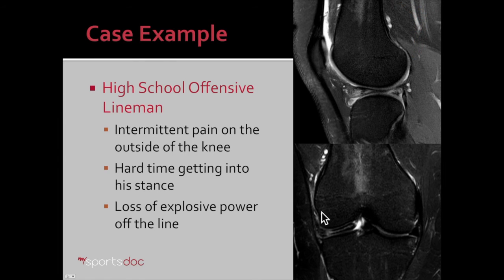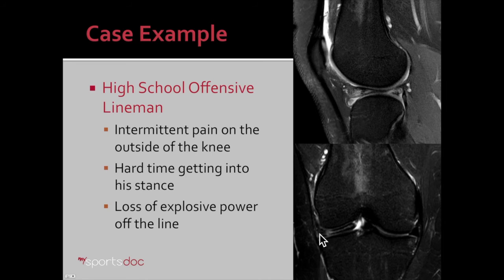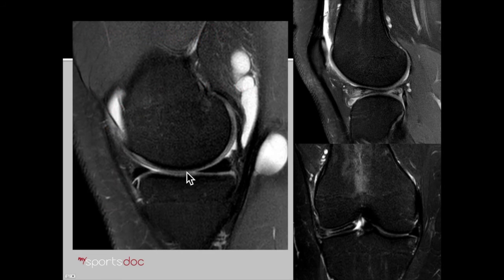Here's his MRI — the same sagittal view we saw before. You can see the discoid meniscus goes all the way across the knee. Looking at that from the front, instead of seeing the c-shaped meniscus with a black triangle, you have the meniscus going all the way across that compartment of the knee. Compare that to a normal meniscus where the black triangle in the front and back of the knee would appear, versus here where it extends all the way across.